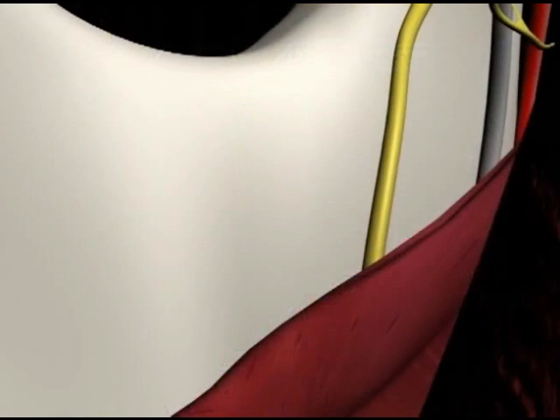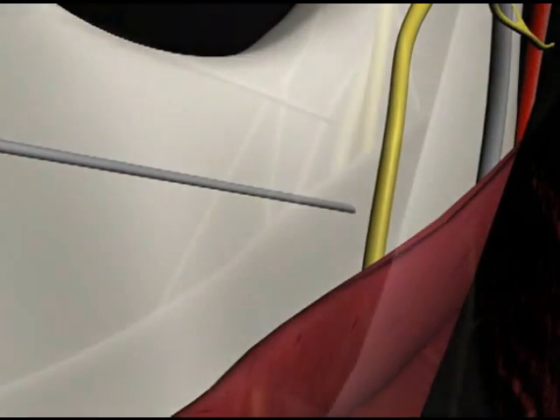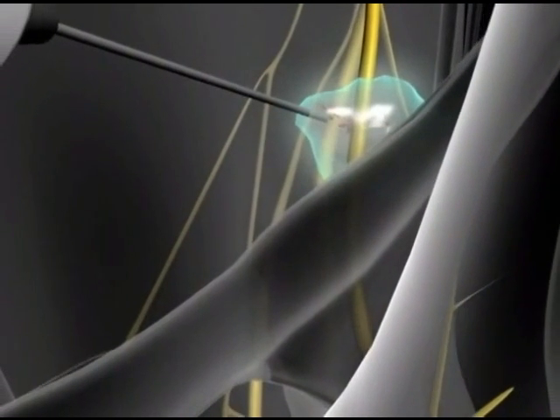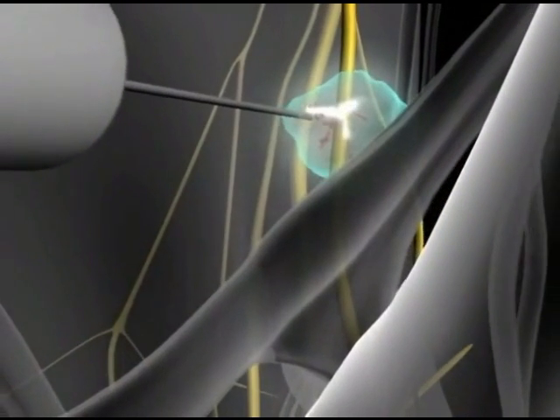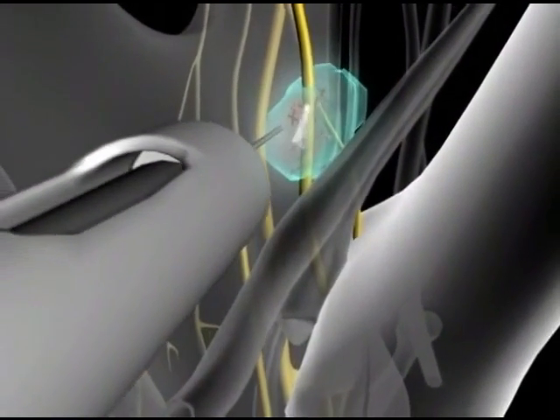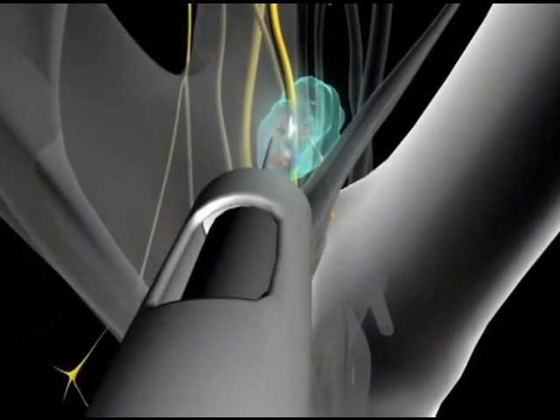After traveling about 20 to 25 millimeters, we finally arrive and make gentle contact with the ramus, ideally just above the mandibular foramen, and very close to the inferior alveolar nerve. We'll pull back a millimeter or two, aspirate, and then deliver the anesthetic. Begin the flow of anesthetic at a slow rate so that you have completed delivering the entire cartridge in about 1 to 2 minutes. Then carefully withdraw the needle, following the same path used for entry.